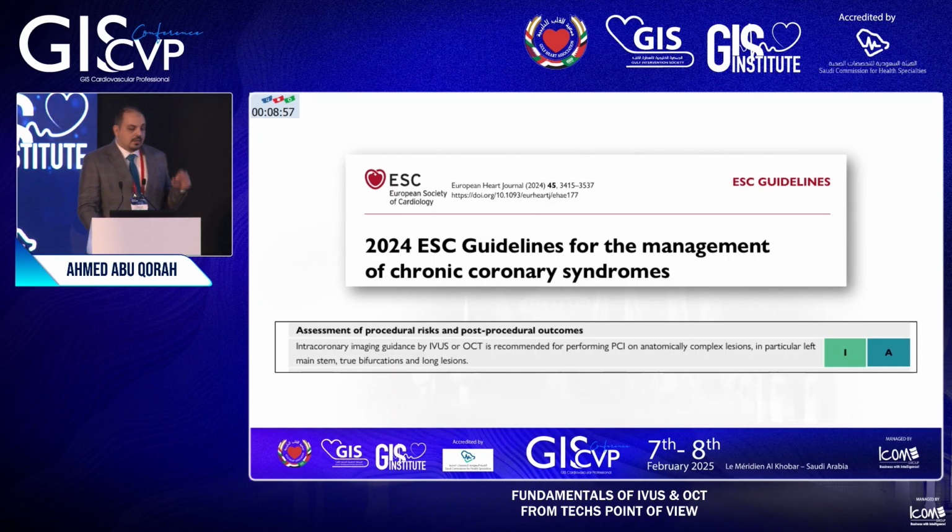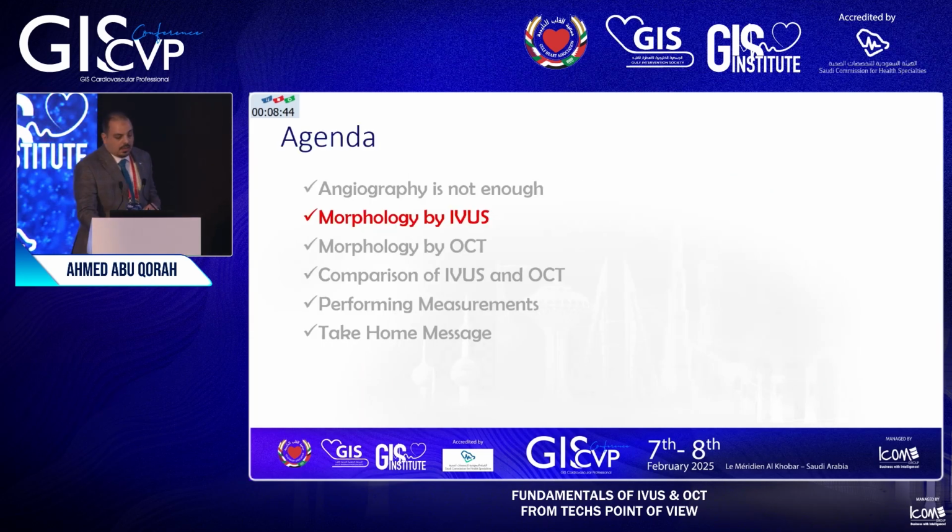The last update from the European Society of Cardiology in 2024 put IVUS and OCT for complex PCI in a class 1, level of evidence A. Now let's go for morphology by IVUS.